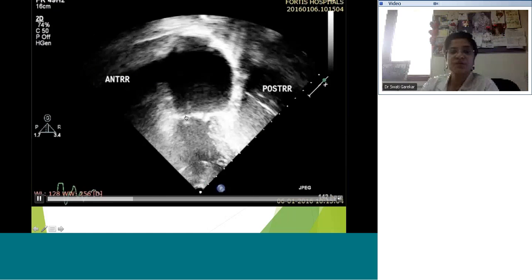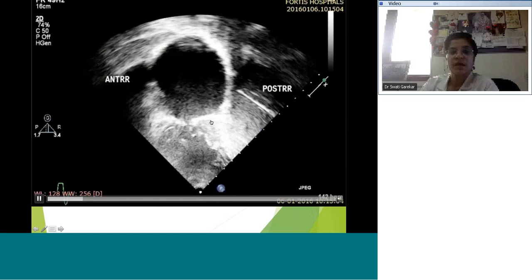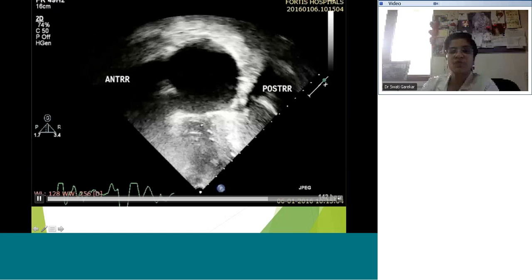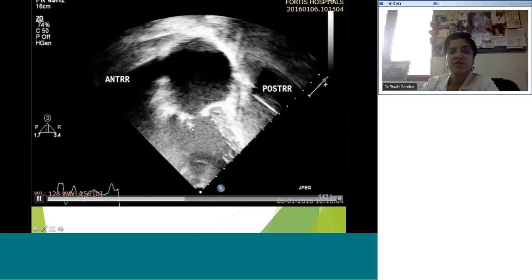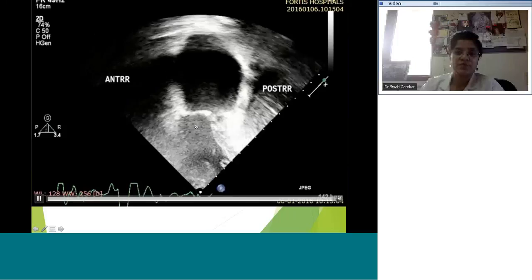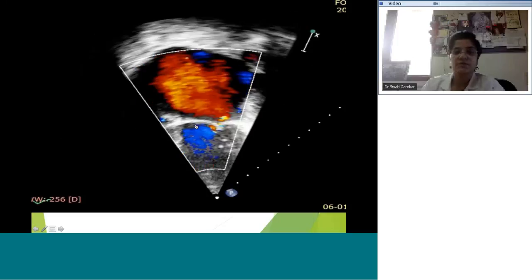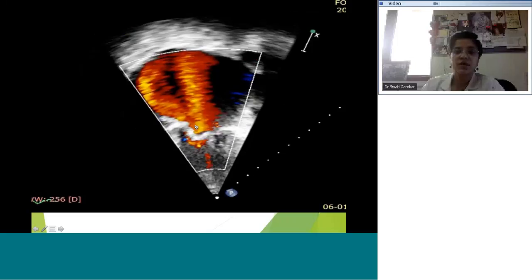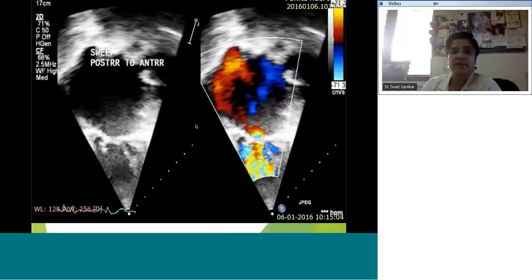In the two chamber view, the anterior and posterior leaflets are labeled. The posterior leaflet hardly moves while the anterior moves fairly well — in fact, one of the chordae might be ruptured as the tip seems to move a little extra. On color Doppler, you've got mitral stenosis with a mean gradient of 17 mmHg, which is very high.